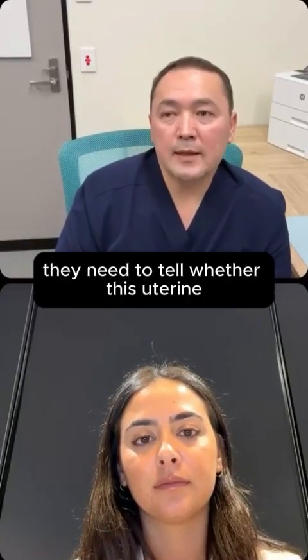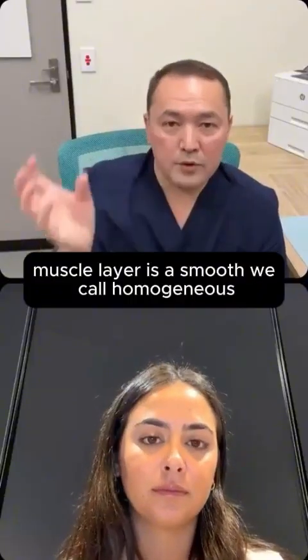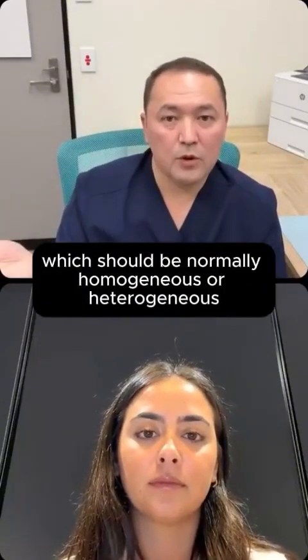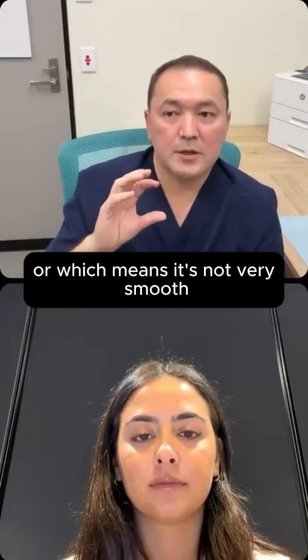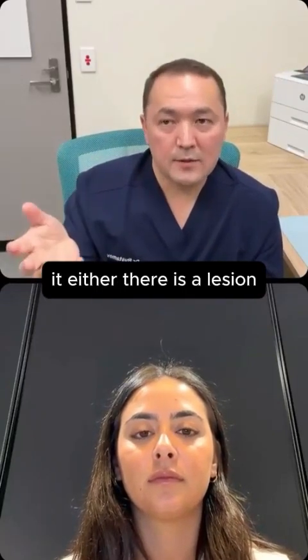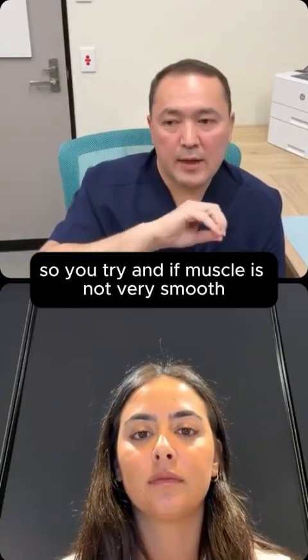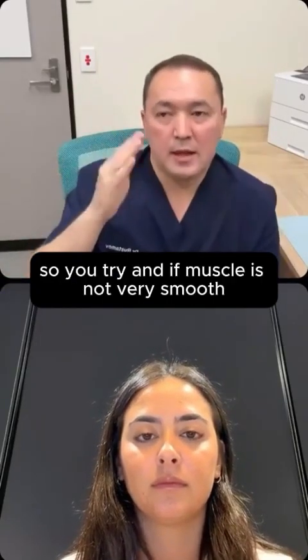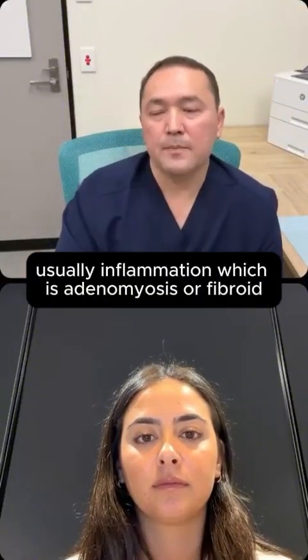They also need to tell whether this uterine muscle layer is smooth, which we call homogeneous, which it normally should be, or heterogeneous, which means it's not very smooth. That generally indicates either there is a lesion, which is usually fibroid, or adenomyosis. So if the muscle is not very smooth, that means there's some pathology there, usually inflammation, which is adenomyosis, or fibroid.